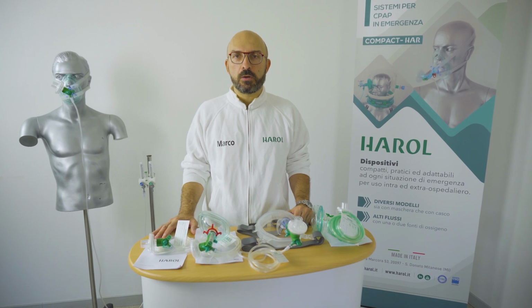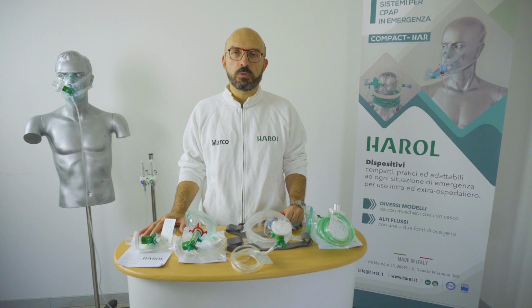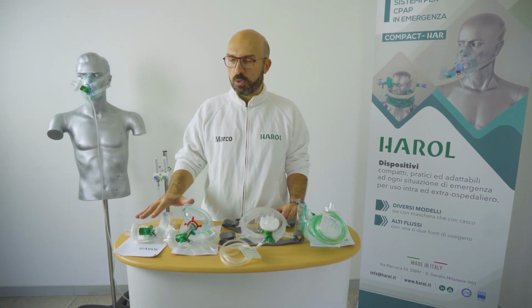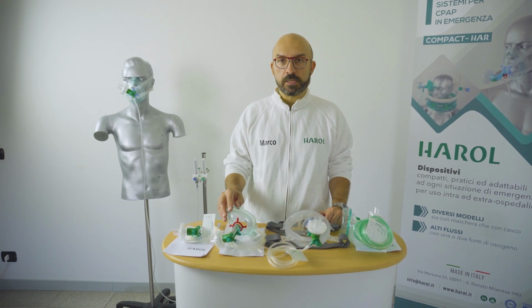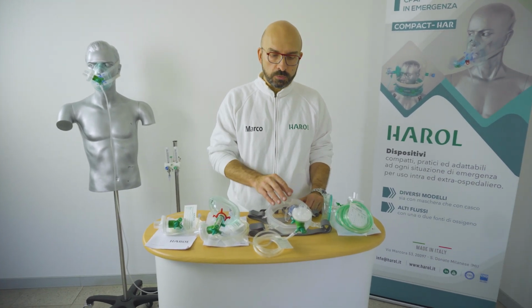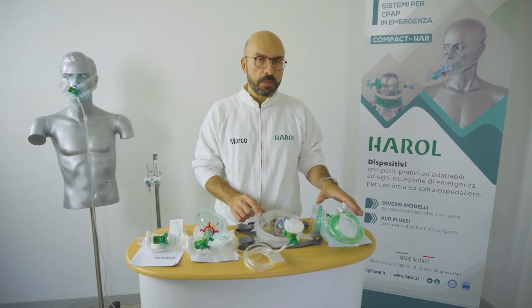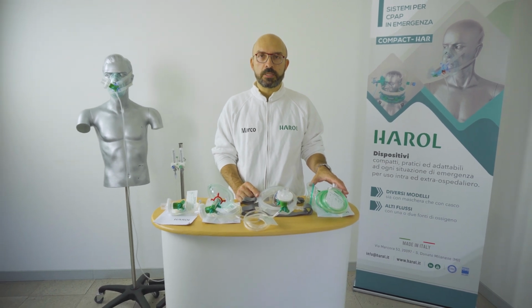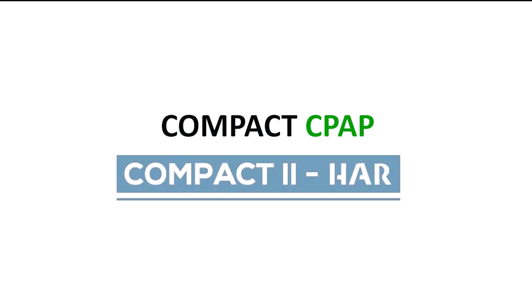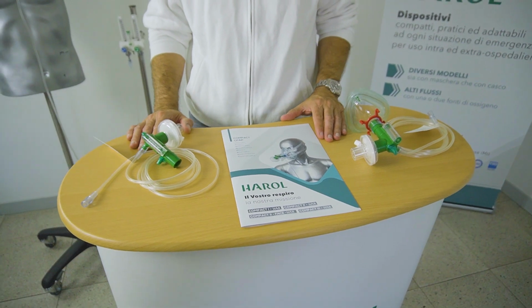Harol proposes two compact models which allow to control the various parameters. We have the Compact2 without mask, the Compact2 with oronasal mask or total face mask, and finally the Compact3 which allows to control all parameters. Let's see the Compact2 model.